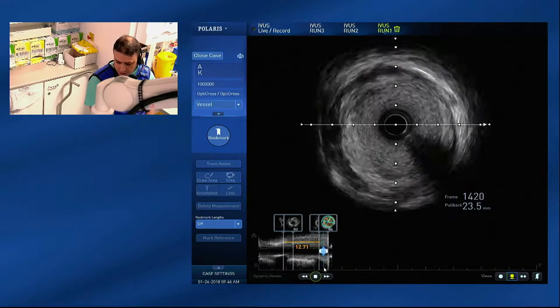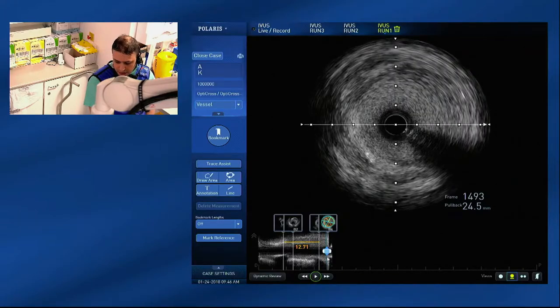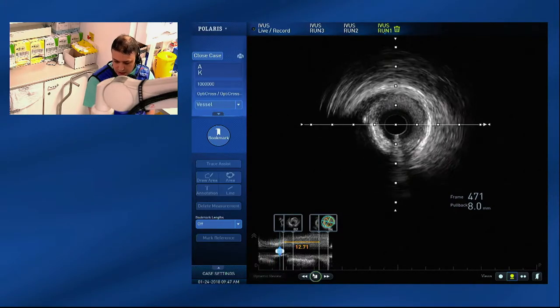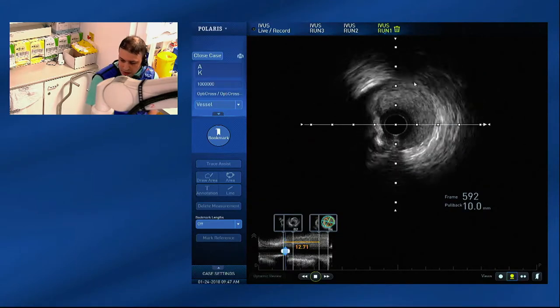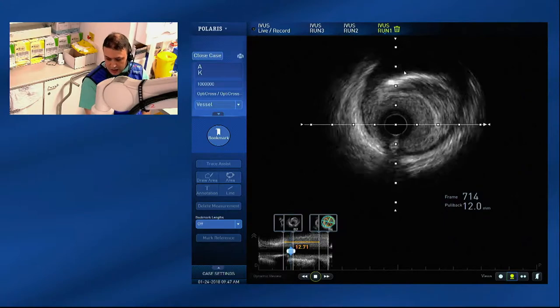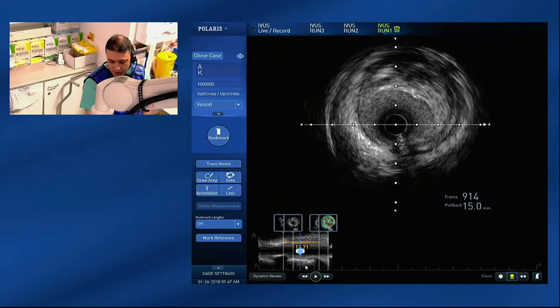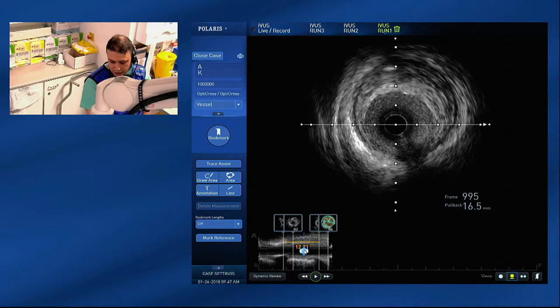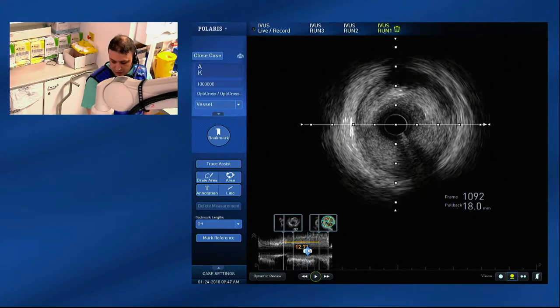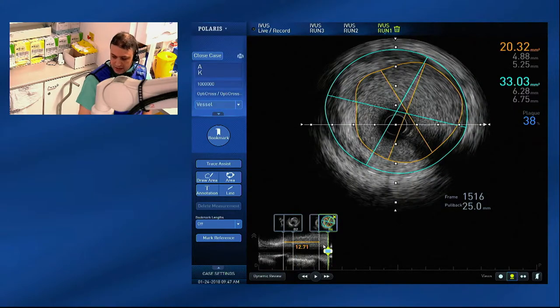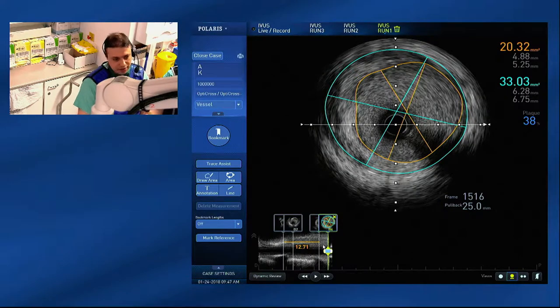We think the LAD origin is coming at approximately 2 o'clock. As you can see, and as we've also seen in the CT, there is calcification in the outer vessel wall of the left anterior descending artery. We measured the distance between the origin of the LAD and the bifurcation with the Circumflex and found it's 12.7 millimetres, suggesting there is enough space to deploy a stent. We also measured the left main stem area and found the lumen diameter is approximately 5 millimetres, indicating that if we need to come back to the left main stem, we can deploy a 4 millimetre stent there.